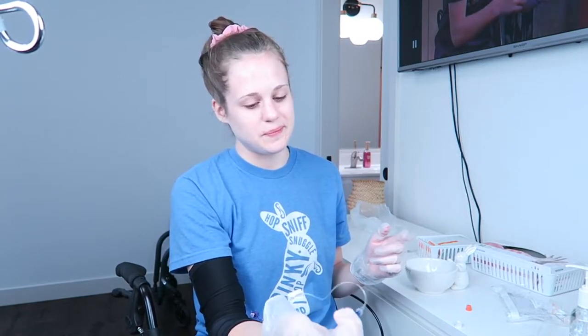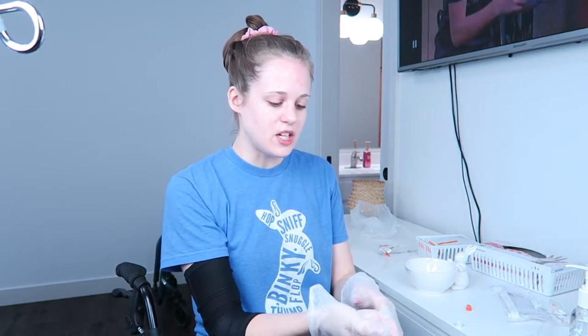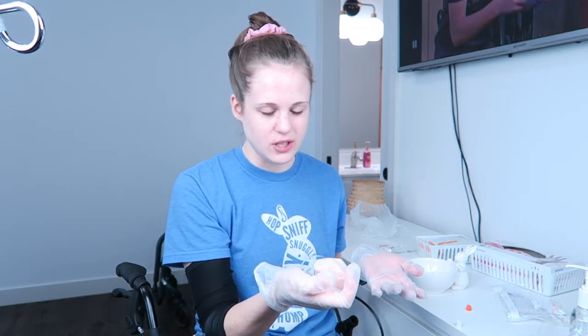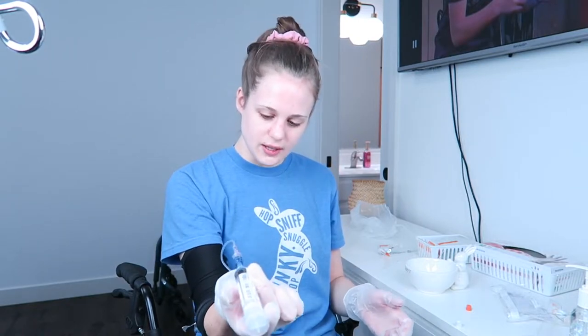If you have a clot in your line, you have to go to the hospital and either try to get the clot out, or they're going to have to pull your line, which is not good. So that's why I check for blood return every single day. I have to do it every single day because I don't have a higher dose of heparin, but some people do it like every 3 days. So I flushed with the saline.